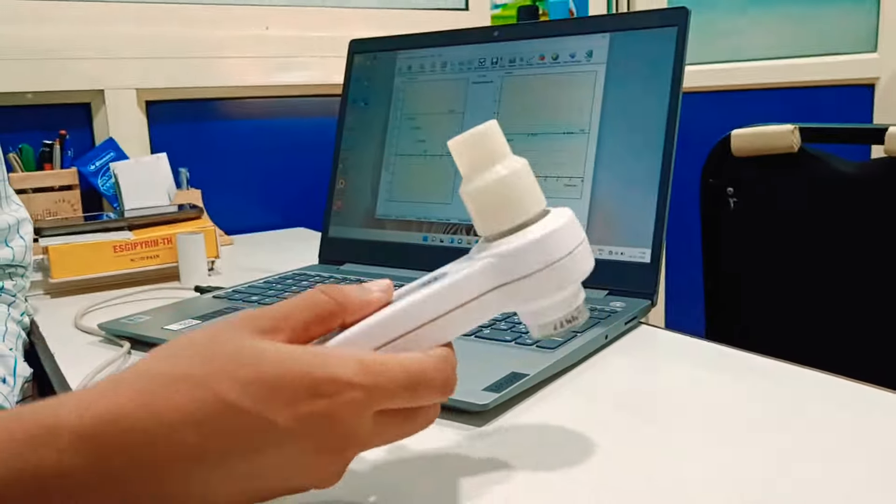Today we are going to learn how to perform the lung function test, basically called spirometry. It is a test to see how the lung functions. When you do a chest X-ray or CT scan, it is just a picture image of the lung. How the lung actually performs is different, and that can be determined only by spirometry or PFT.